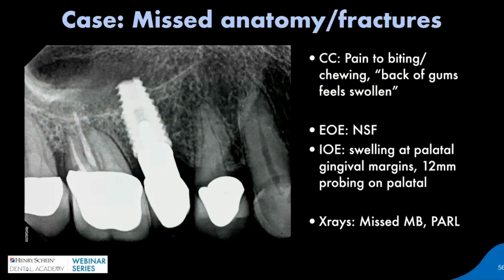Anytime there's a deep probing depth, that just means that there's some areas of bone loss. This, or a J-shaped lesion, can also just mean areas of bone loss. This can be due to either a very long-standing chronic apical periodontitis that goes up the side of the tooth, so a sulcular sinus tract. It can be due to multiple portals of exit along the tooth that can join and then make it look like it's J-shaped. And it can also be due to just where the canal exits. If it exits higher up the tooth, it may look a little bit more off-centered or J-shaped as well.